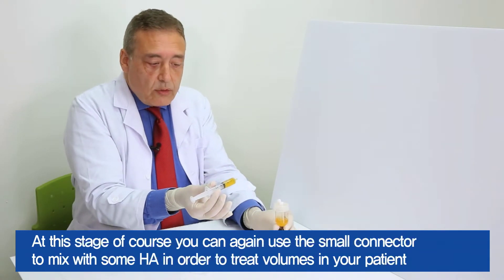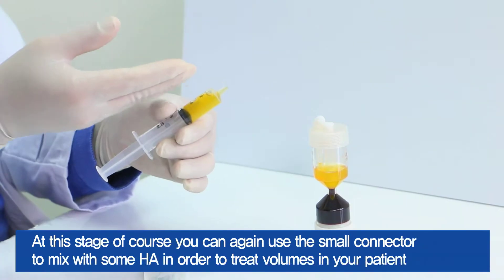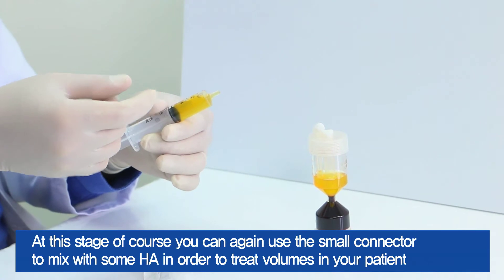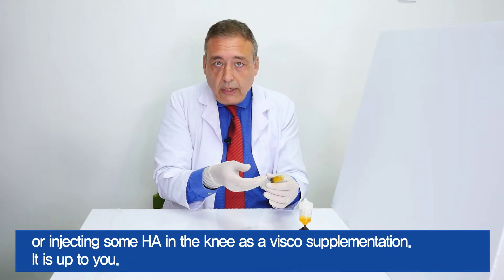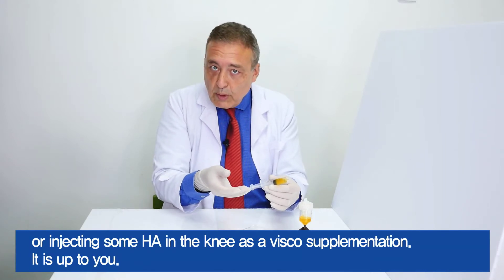At this stage, you can again use the small connector to mix with some HA in order to treat volumes in your patient, or inject some HA in the knee as a visco-supplementation. It's up to you.